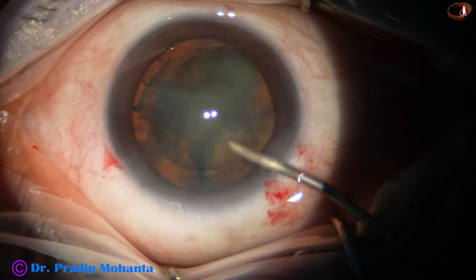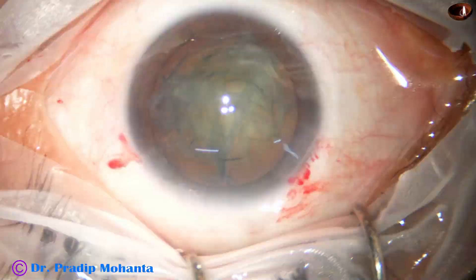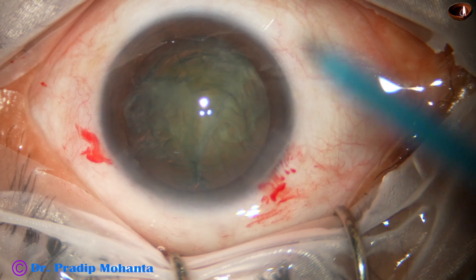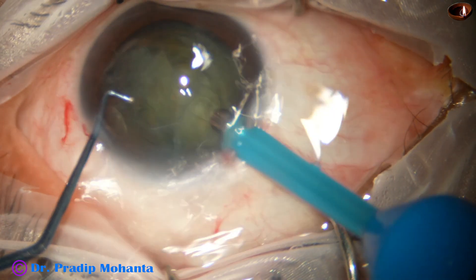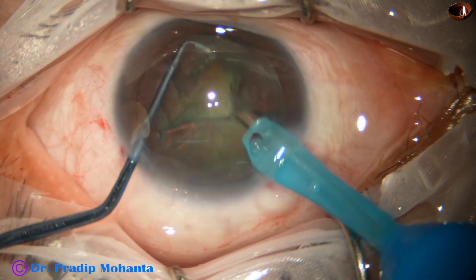The anterior chamber is filled up with viscoelastic. The handpiece is taken and goes into the anterior chamber with its bevel down. The same sustainer that has been used for the pre-chop is in the left hand.